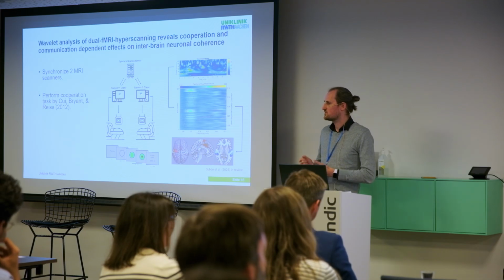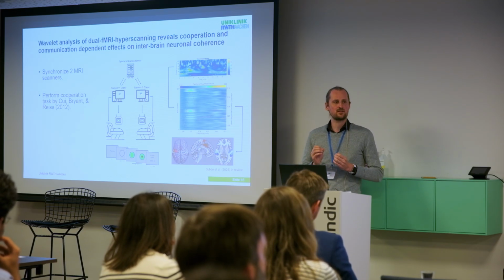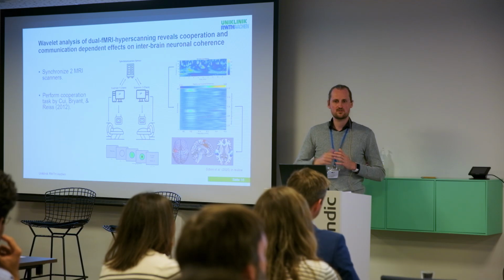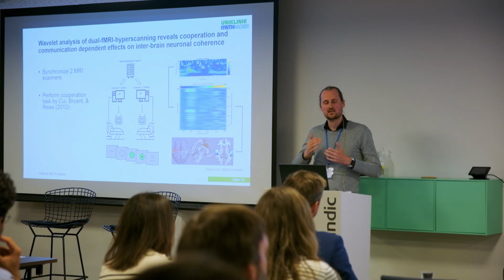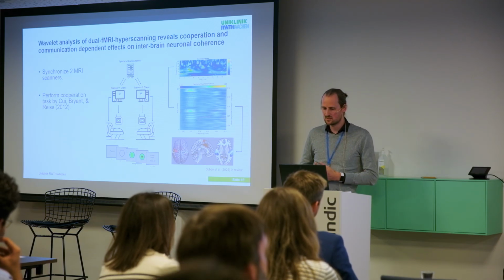Only the task is not to press as fast as possible. No, the task is to press at the same time as the other participant. Keep in mind, one of our MRI scanners is located at -2 in the basement, the other is on the 3rd floor. They are separated. They have no way of communicating with each other, but somehow they are tasked with trying to synchronize the task. This makes it a cooperation task.